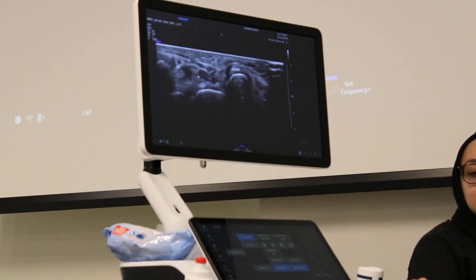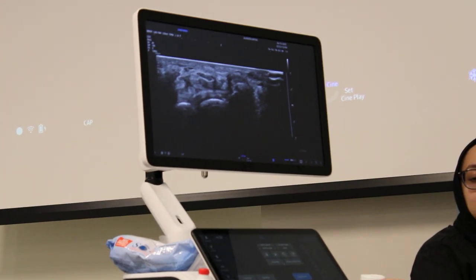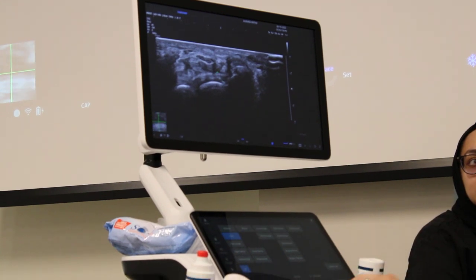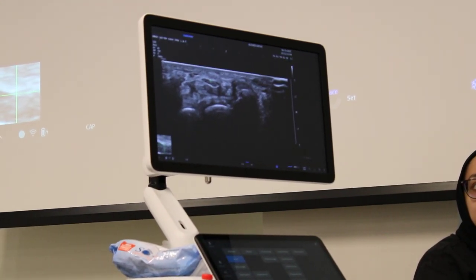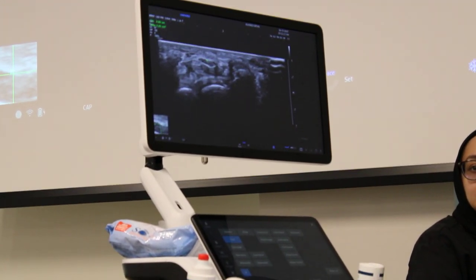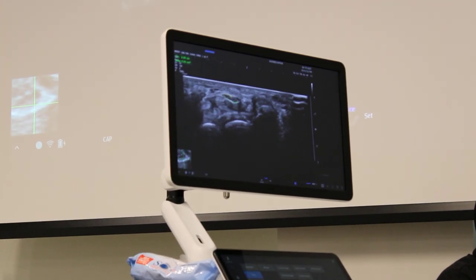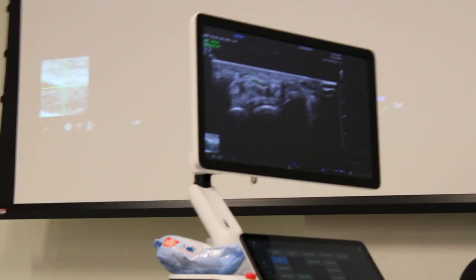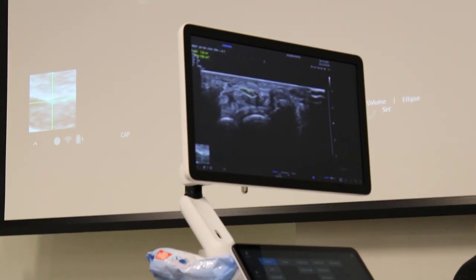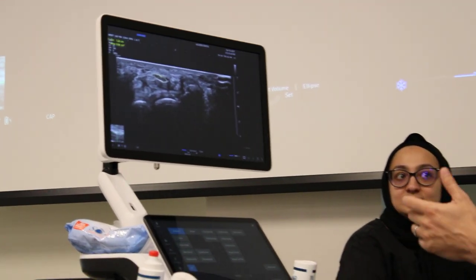One way that you can actually diagnose carpal tunnel, in addition to having a good history and a good physical exam, you just press — you can look at that nerve. The nerve gets swollen and big when it gets pinched. So you just go here and circle around the nerve to see if it's swollen. And you can see that Nikina doesn't have carpal tunnel at six millimeters.